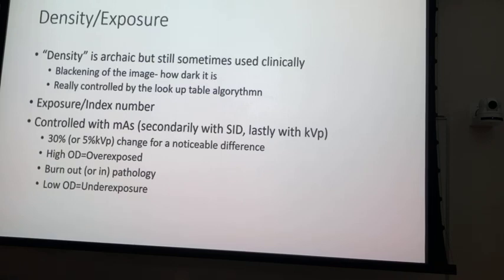So whenever we're talking about optical density, high optical density just means that we're overexposed. Your S number, depending on who your manufacturer is, a low S number may indicate overexposure, and why they did that, I just don't know. But there is a direct relationship.